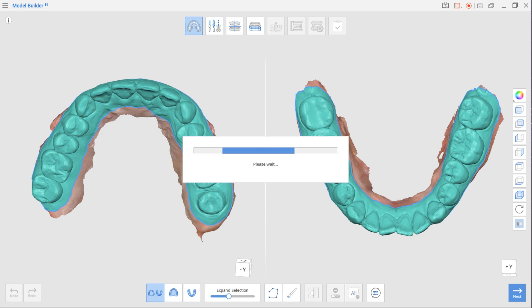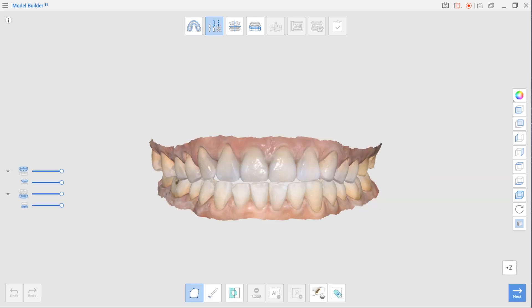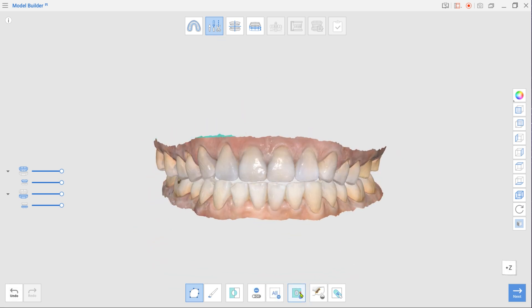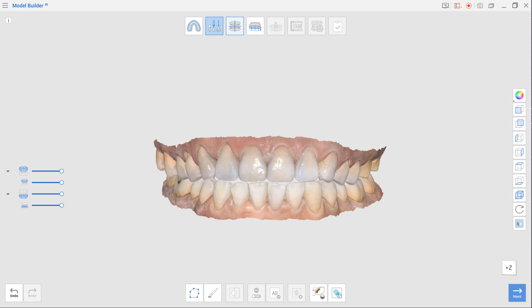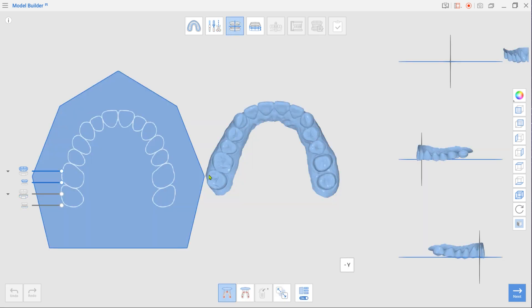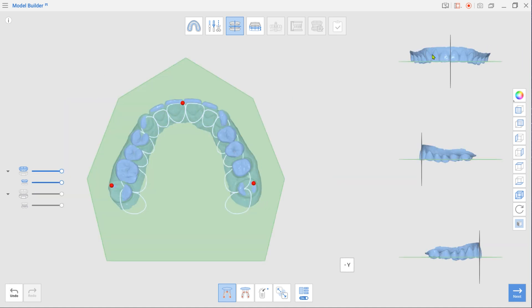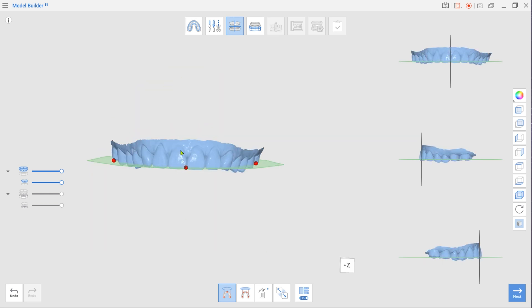Click Next to enter Edit mode, where you can trim the scan data or fill in holes. Once done, move to Alignment mode. Select three points on the data as shown in the video to align it with the virtual occlusal plane. Ensure the data is properly positioned by reviewing it from all angles in multi-view.